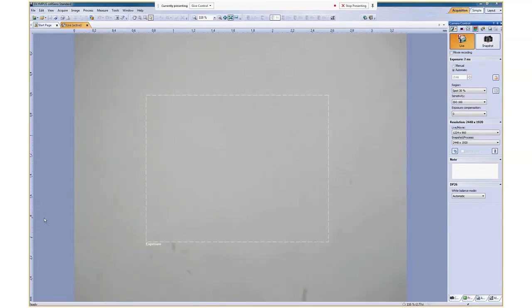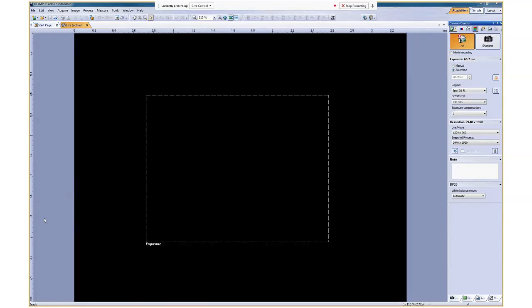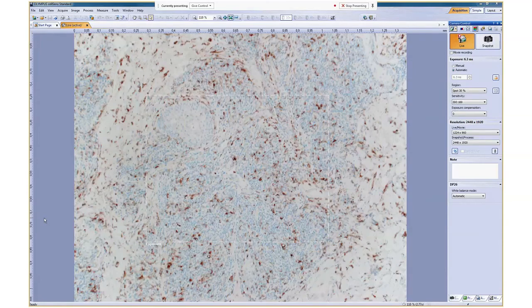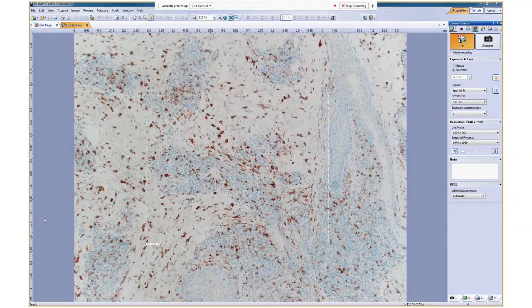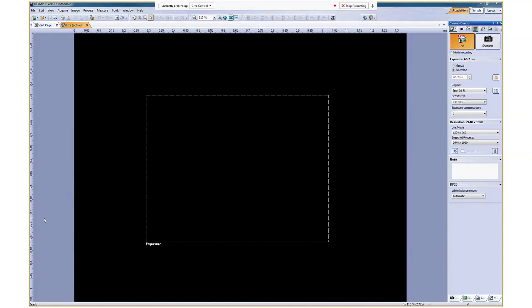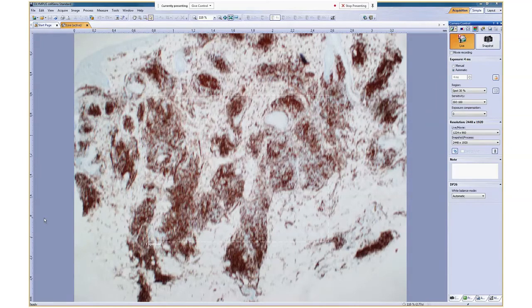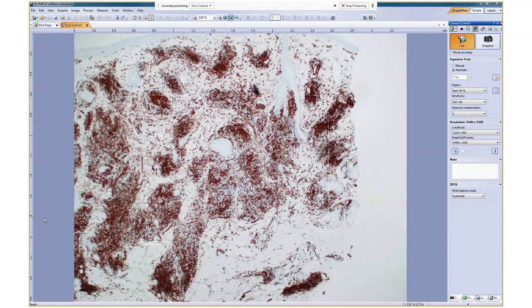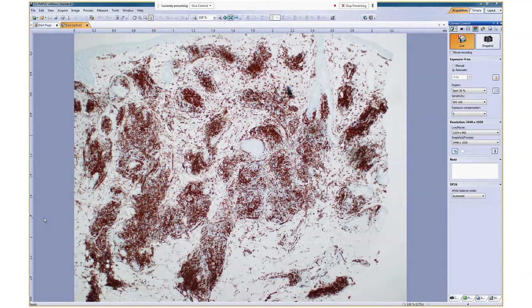Now I did mention that the infiltrate tends to be quite mixed, so aside from the lymphoid cells, this stain here, the CD68, is highlighting all the histiocytes. So there are quite a few scattered histiocytes about this infiltrate. I also want to show you the CD123, which should highlight plasmacytoid dendritic cells, and there's quite a bunch of them in here. Now, there's some overlap with your histiocytoid cells with this stain, but it's also picking up plasmacytoid dendritic cells, so quite a good infiltrate.